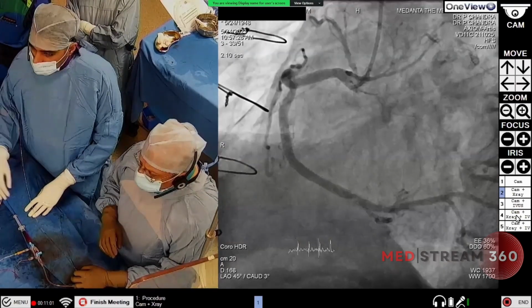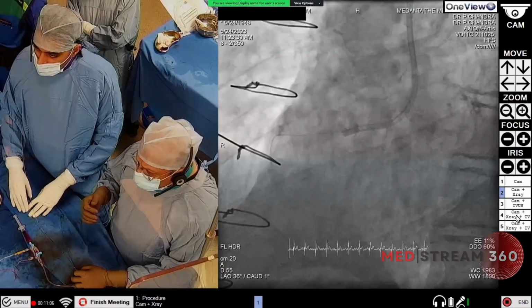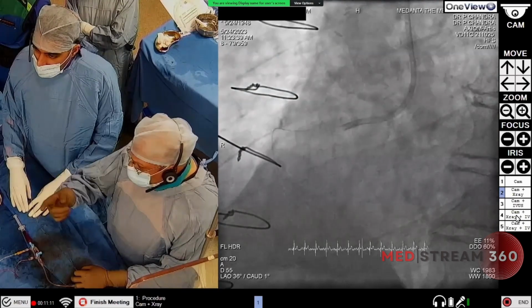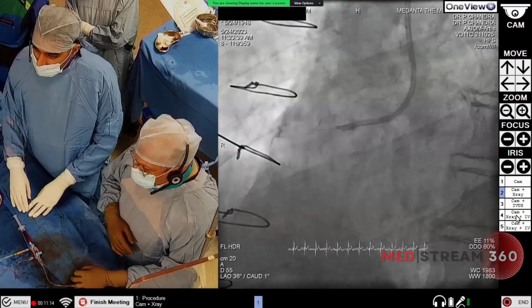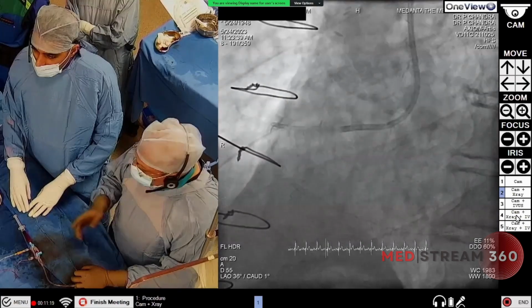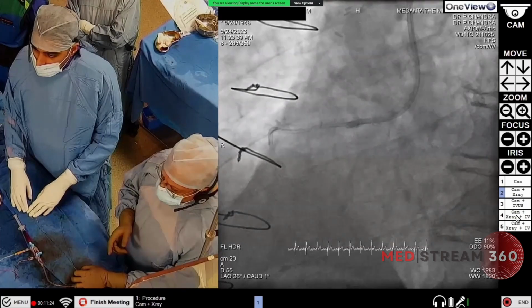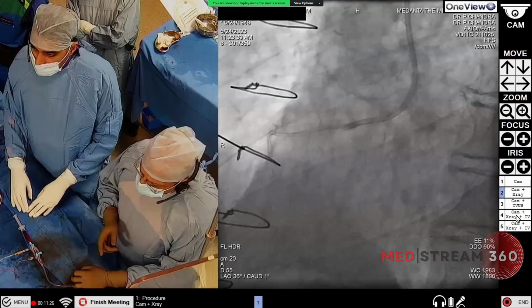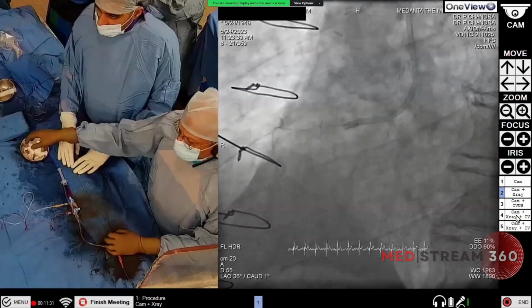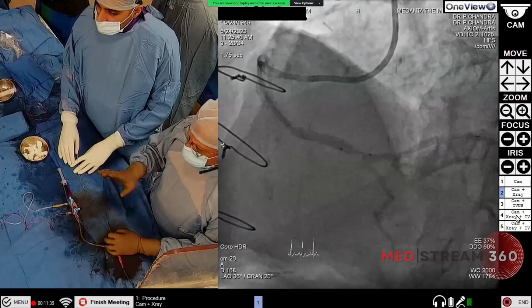Yes. And also at the same time, we decided that we should use a guide extension support. Most likely it will be required, because you see there is a calcium at that loop area in the middle. And so we took this guide liner, and this is not the guide, this is the guide +2 extended lumen guide extension, EL, and this is 1.43 in the lumen area, and this is in good position now without any compromise of the flow.